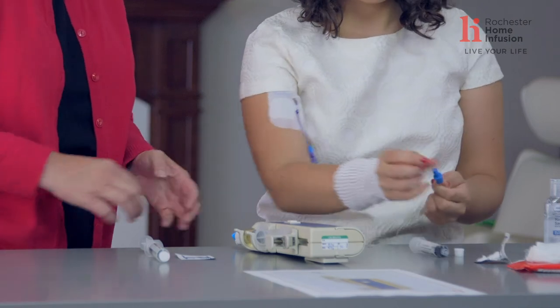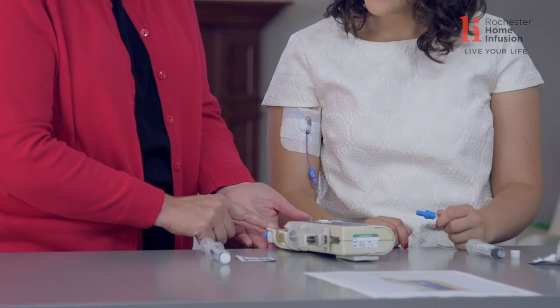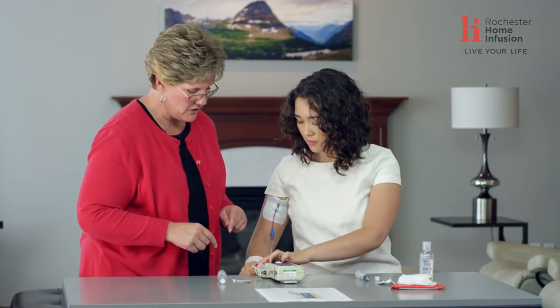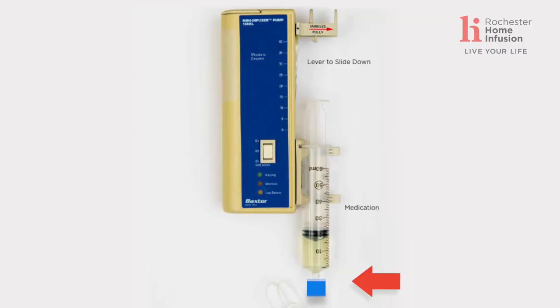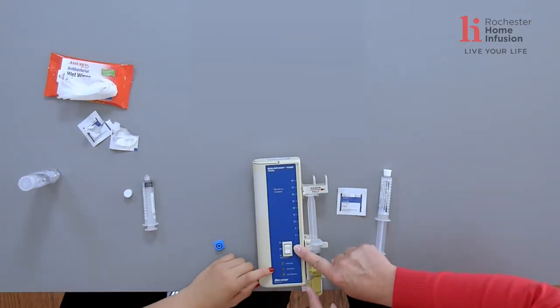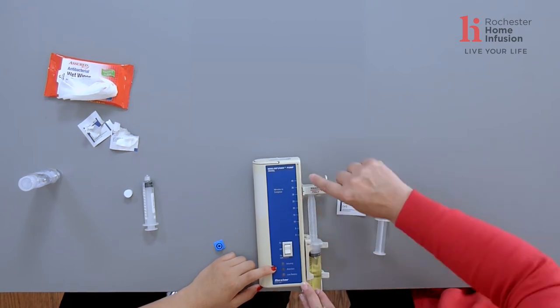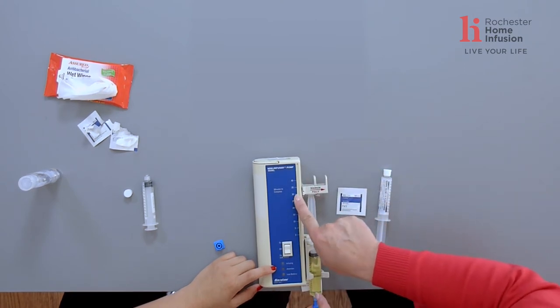Slide your pump towards the edge of the table so that the end of the syringe is off the table. Unscrew the cap on your medication syringe and set it aside. Take your clave, meet it to the end of the syringe, push in, and turn on — now you're connected. On the pump, there's a little arrow on the top of your lever; that arrow shows how long the infusion will take. For this syringe, the arrow indicates 30 minutes.